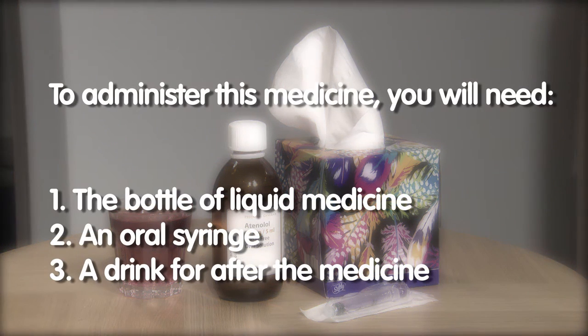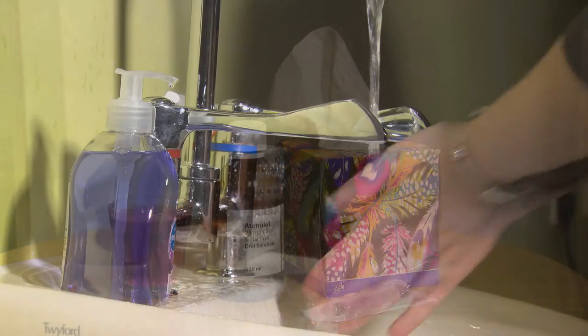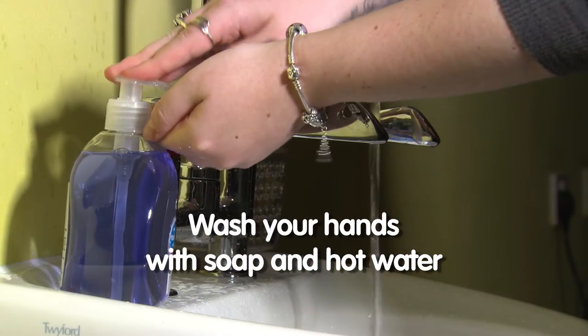To administer this medicine you will need the bottle of liquid medicine fitted with a bung, an oral syringe, and a drink for after the medicine to take the taste away. Wash your hands with soap and hot water before starting.